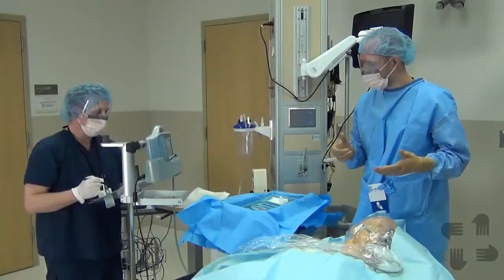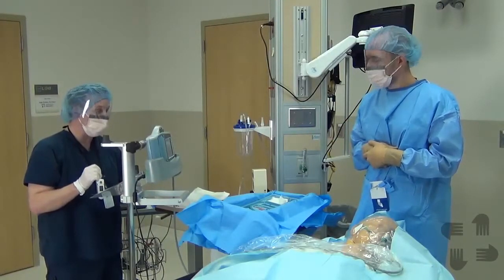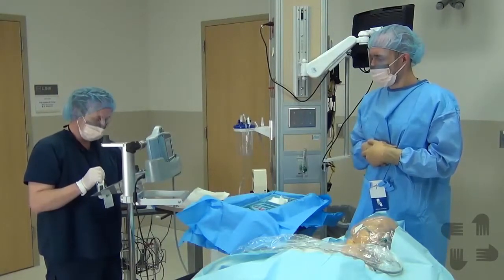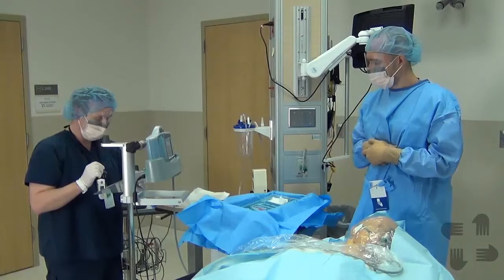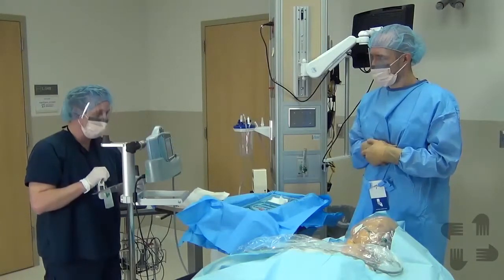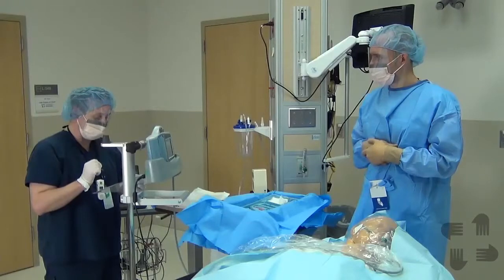Okay, so before we cannulate the vein, let's just review the checklist, make sure we're not missing something. Right now I have so far that the site was prepped appropriately, hand hygiene is performed, large sterile drape used to cover patient, sterile gloves, hat, and mask, and all necessities worn by the physician and any person in the sterile field. And patient in the proper position. Yes. Now we're going to the local anesthetic to start the procedure. Okay.